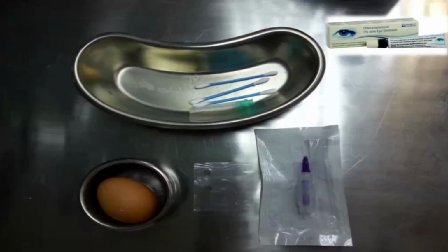So the other thing, beside all the cutting inside the intraocular surgery, sometimes you can do some simple things as well. This instrument, you can learn how to use it for cornea gluing. I didn't talk in the details. Most of the time, you can always Google how to do certain procedures in the wet lab.